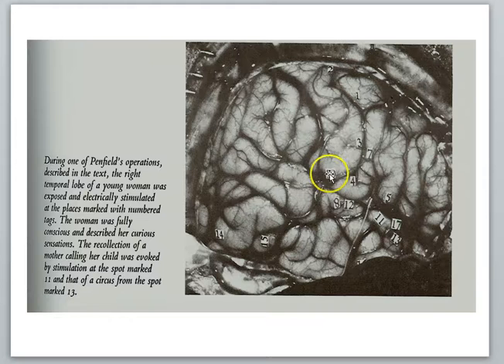So the key to the technique is measuring changes in blood flow, which means that fMRI is not directly measuring brain activity, it's an indirect measure. Changes in blood flow are a proxy for brain activity in a certain region.